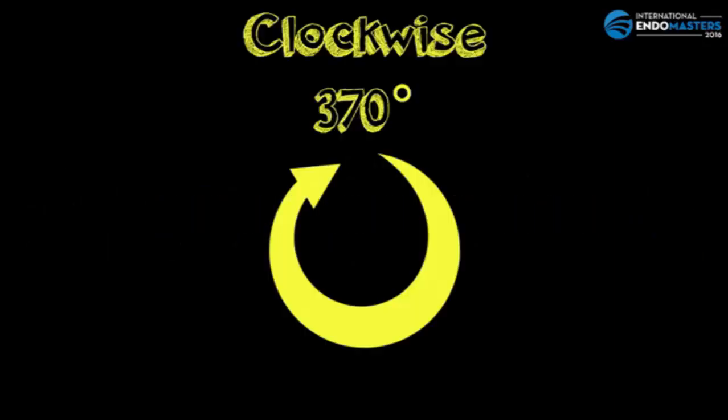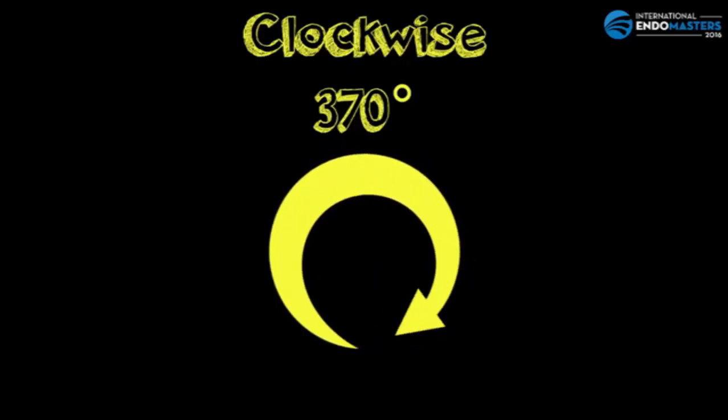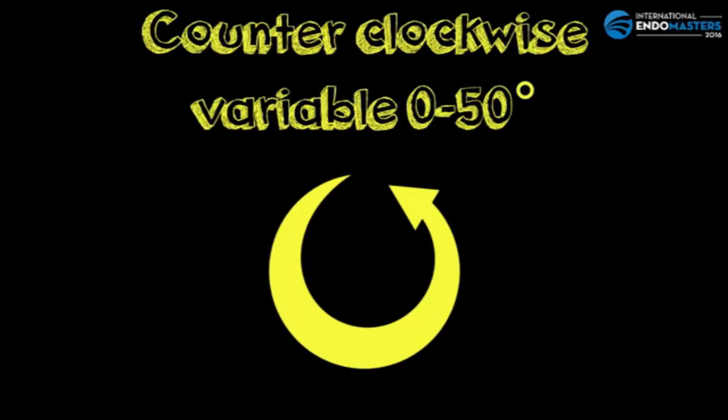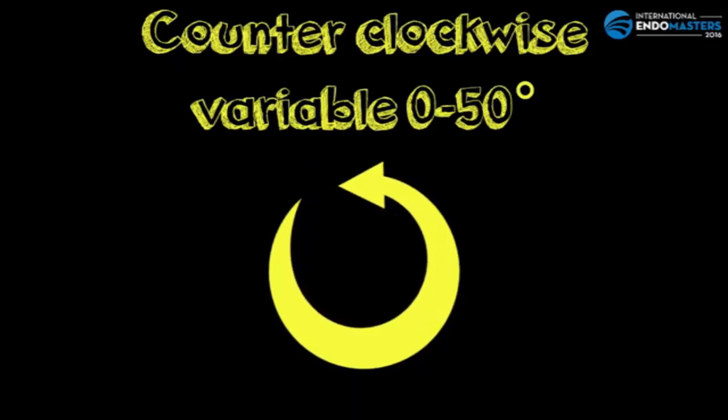The adaptive motion with load. In this case, the file is going to rotate 370 degrees to the right. And then we are going to have a counterclockwise motion.